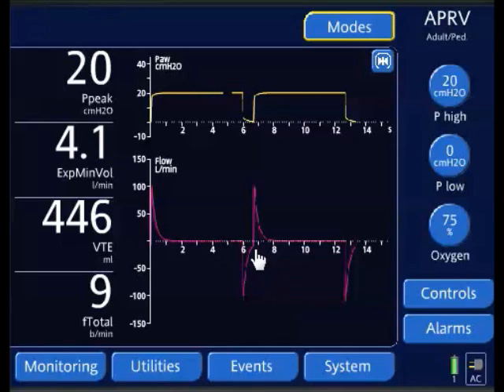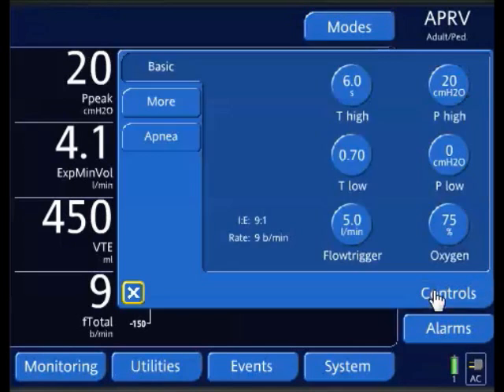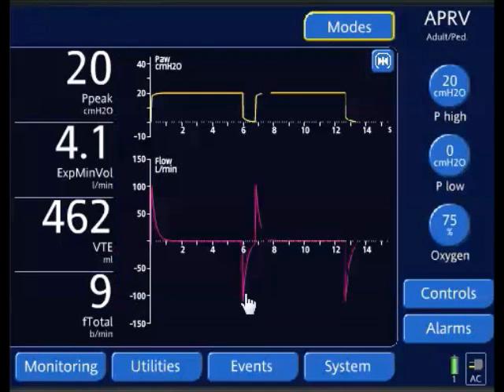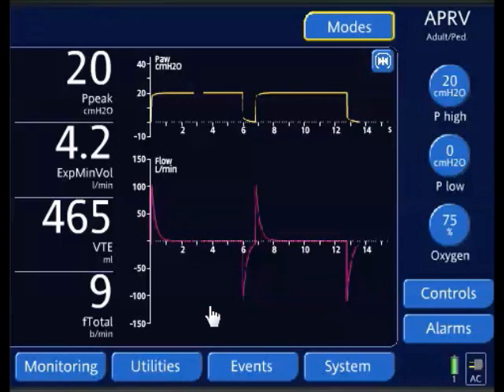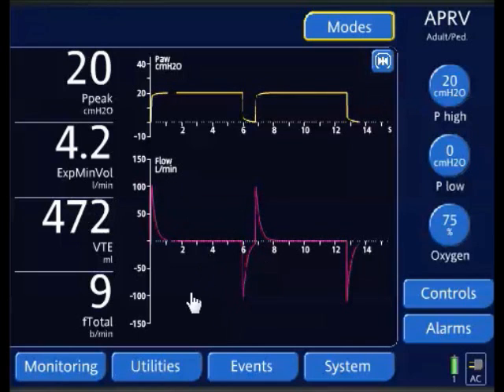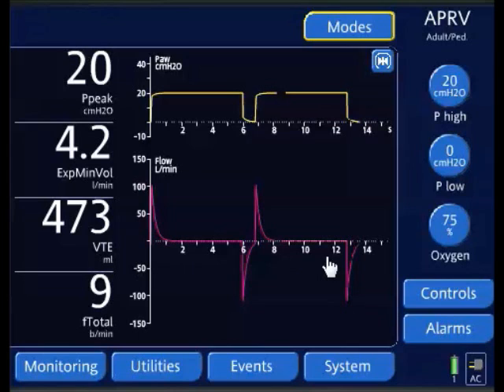We lengthen the T-low a little more and we're pretty much almost at baseline. Let's extend it out to the calculated value of four expiratory time constants and see what the waveform looks like. Waiting for the next breath — and as you can see, we're back to baseline. This reinforces that I can use waveform diagnostics to confirm my settings are appropriate. This is one component of the technique.